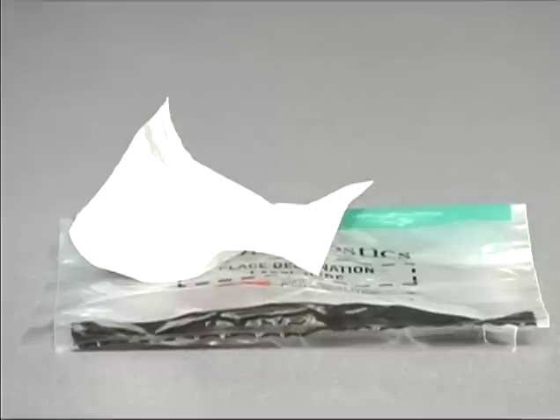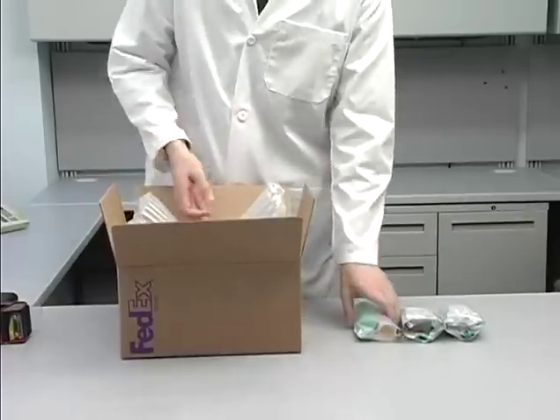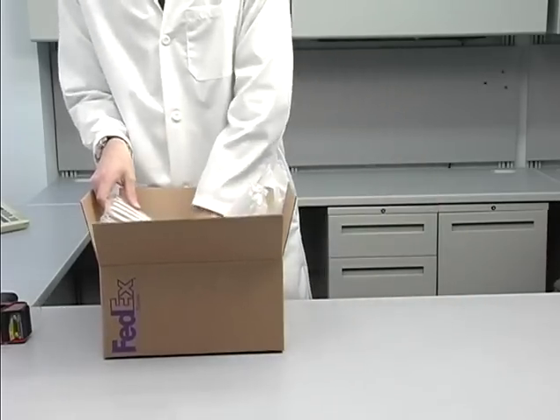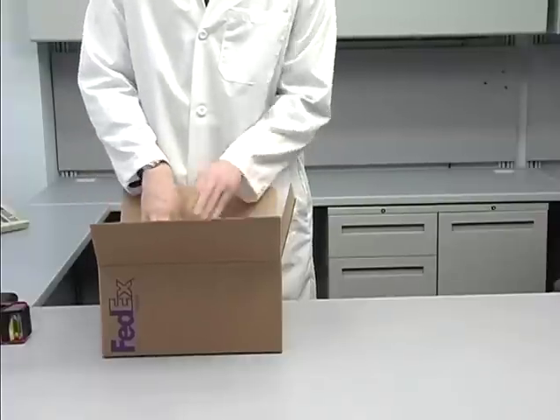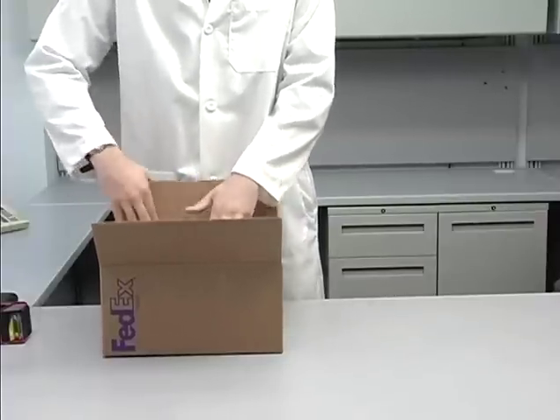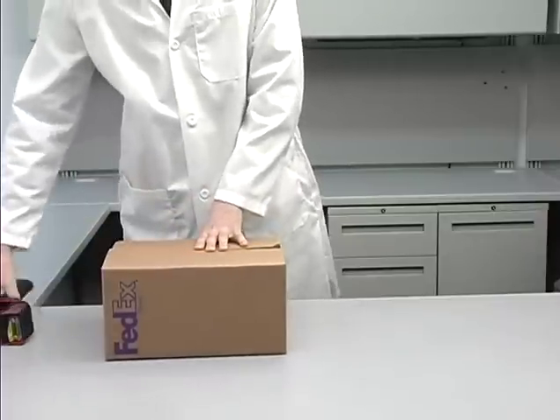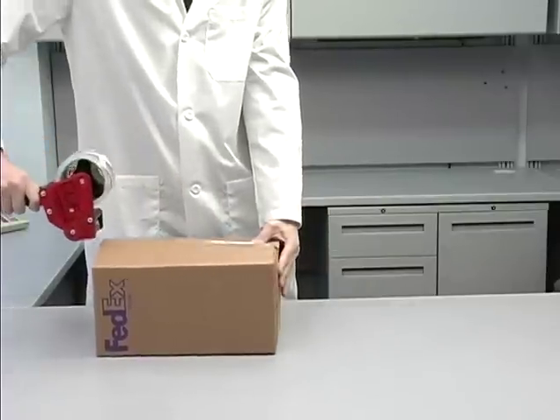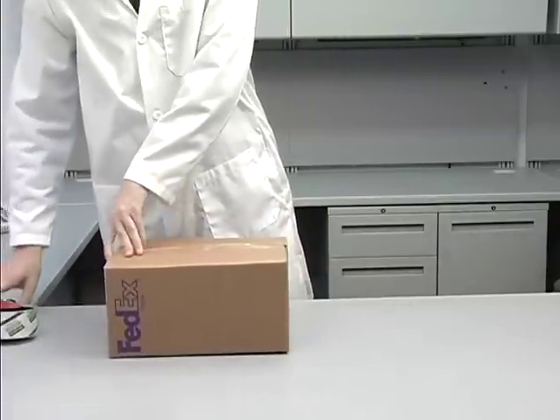Each collection kit must also contain enough material to absorb the contents of both specimen bottles. The absorbent material must fit in the pouch of the leak-resistant plastic bag that holds the specimen bottles. A shipping container must be used to transport the specimens unless a laboratory courier picks up the specimens and hand delivers them to the lab. The container can be a standard courier box, small cardboard box, or plastic container. However, it must adequately protect the specimen bottles from damage during transport from the collection site to the laboratory.